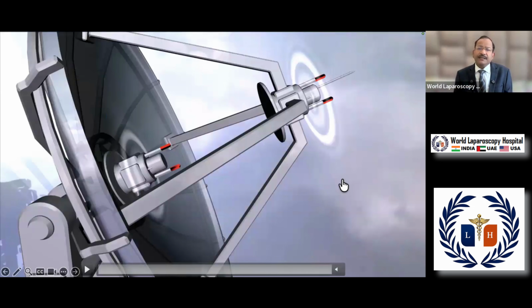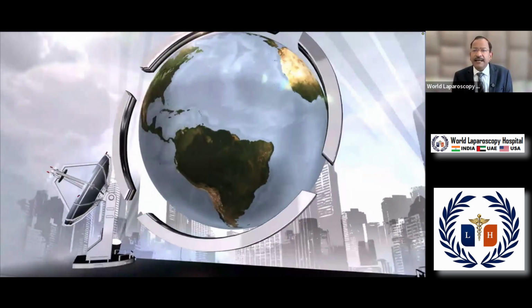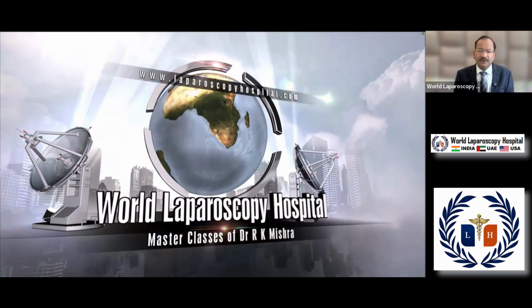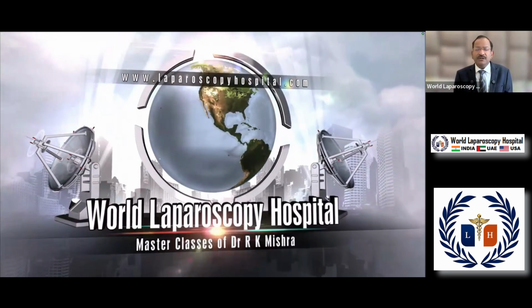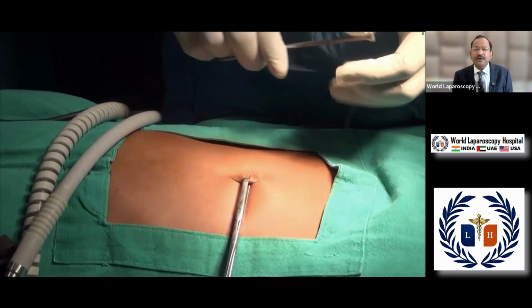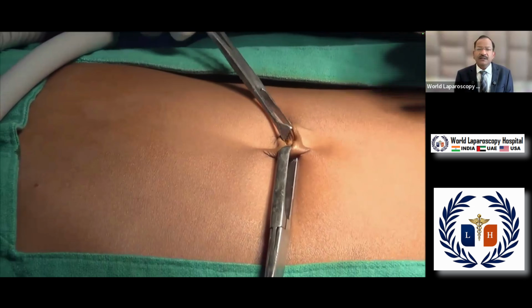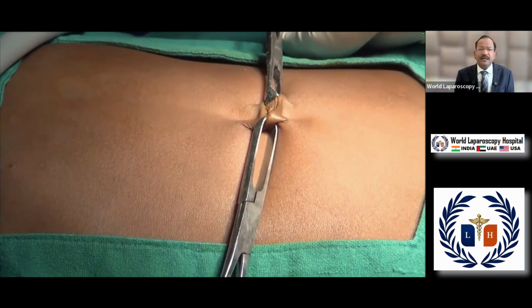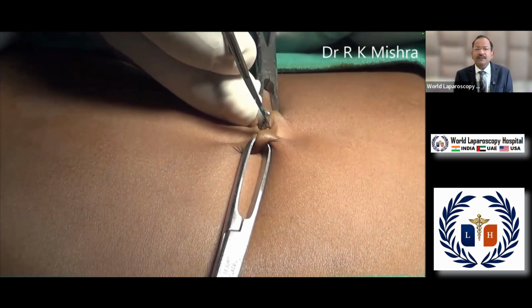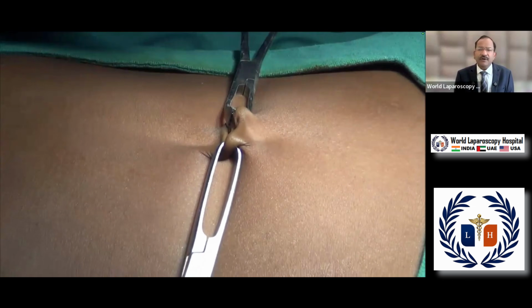So let us see a few examples. First I am going to demonstrate in a small child, and then I will also demonstrate in an adult how to do it. Now this is a pediatric patient, only a 7-year-old child. We can see 2 Allis forceps applied at the inferior crease of the umbilicus, and a small stab wound you will give over the inferior crease of the umbilicus.